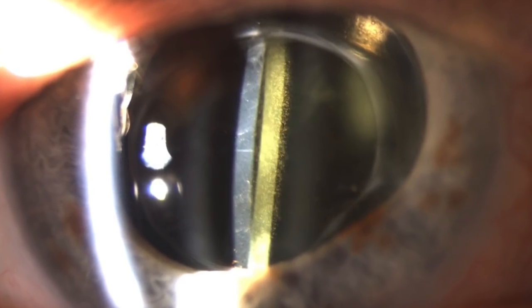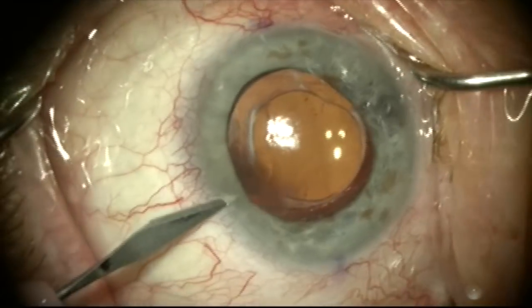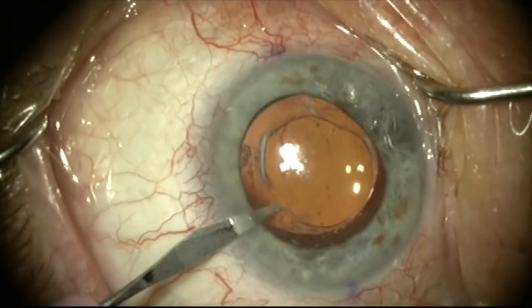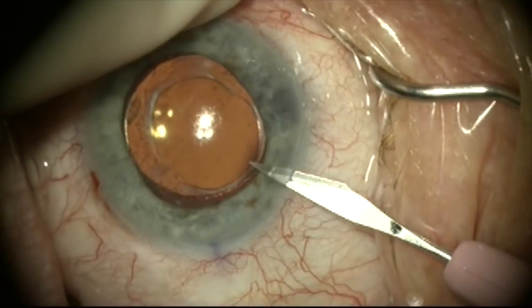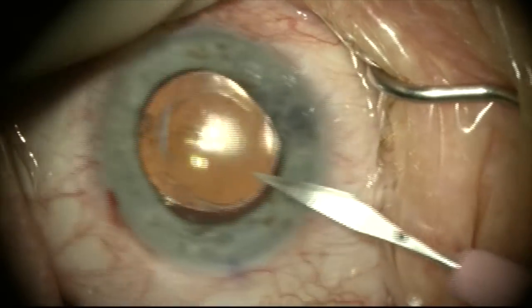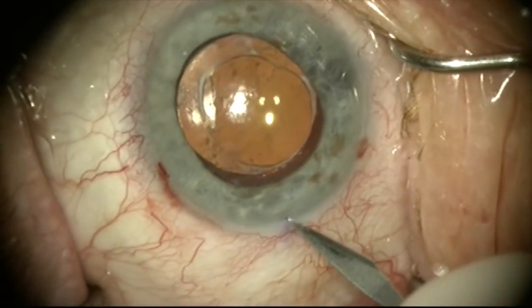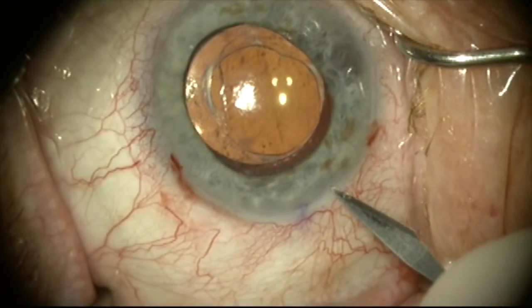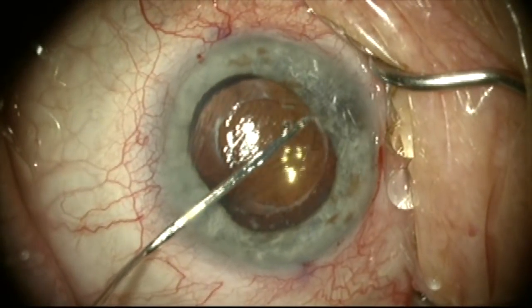This is a functionally monocular patient who has an Alcon AcrySof lens that was placed 13 years ago. It has severe glistenings and she is bothered by decreased vision and glare. We've decided to do a lens exchange for a new clear lens, so we're going to dissect out this lens which has been in place for a long time and place a new lens to try to improve her vision.